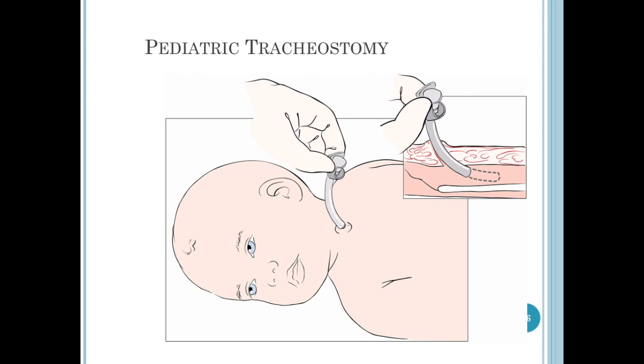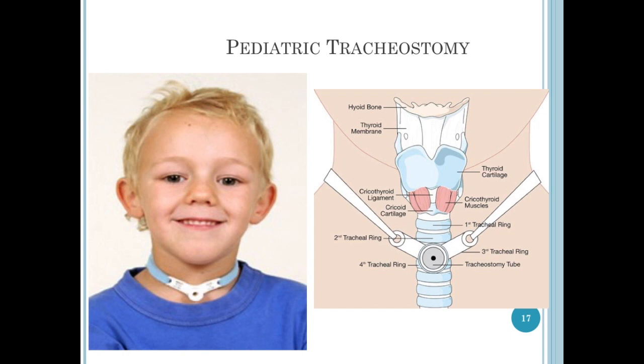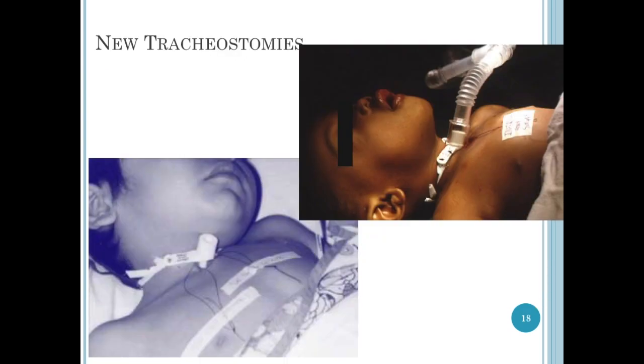This photo demonstrates a tracheostomy tube inserted. And here's a little guy who has a trach tube, and he's very used to it. This child recently had the tracheostomy placed, and you can see the sutures. So until this heals enough, we're going to keep those sutures in place.